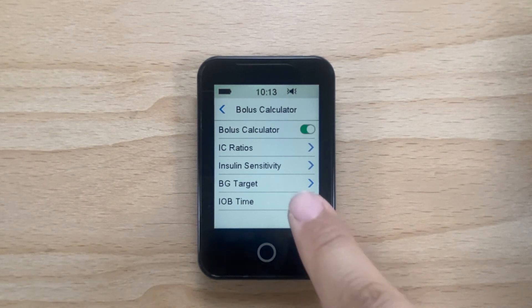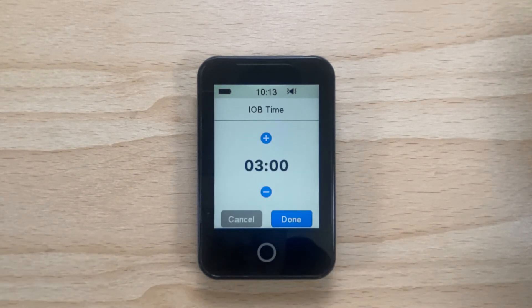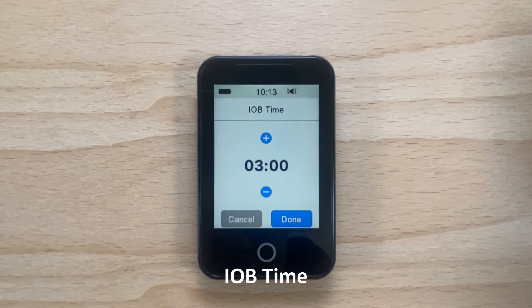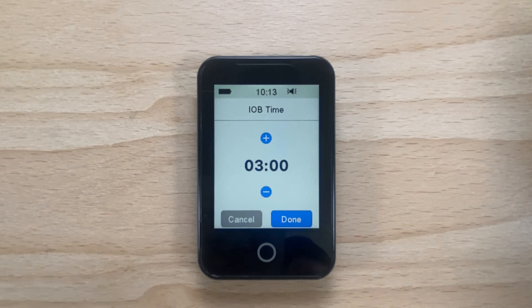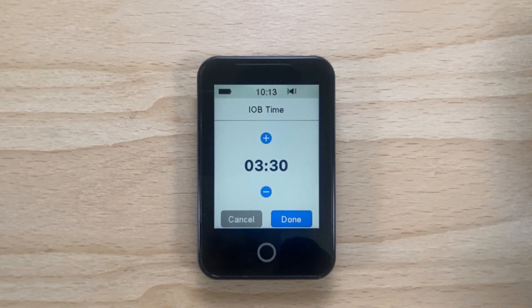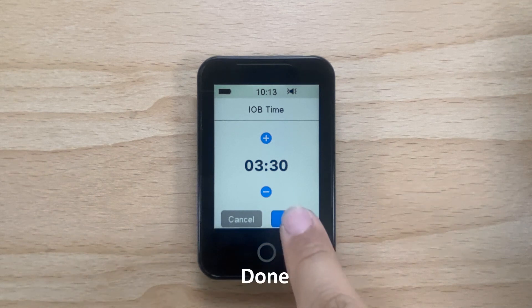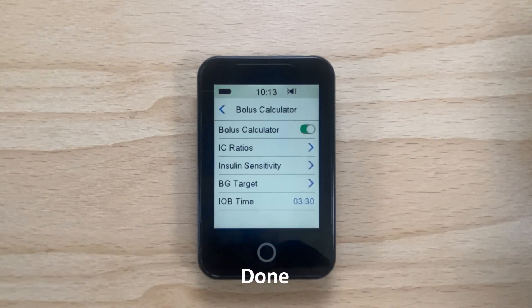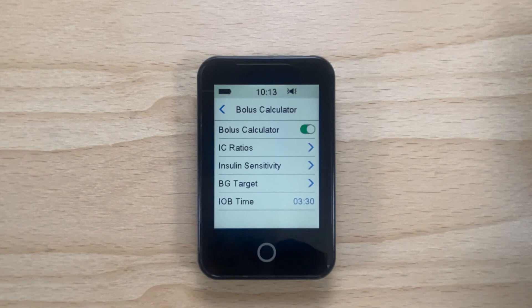Now you can set your insulin on board time for your pump by tapping on IOB Time. You can adjust the IOB time by tapping on the plus or minus. Now tap Done. The bolus calculator is now set up and ready to use.